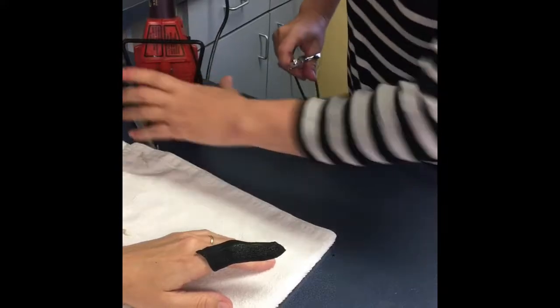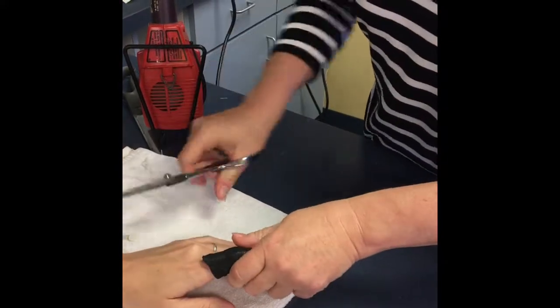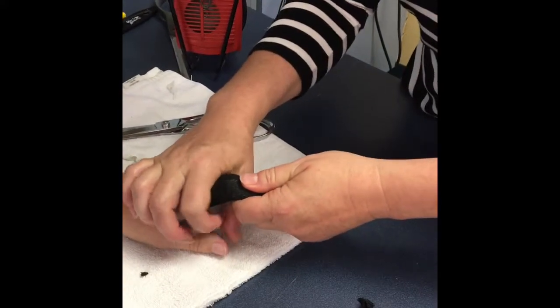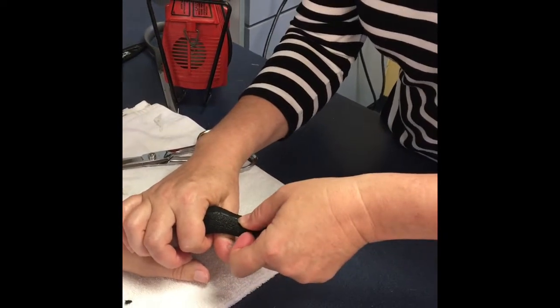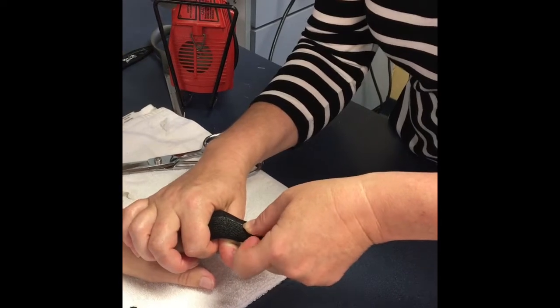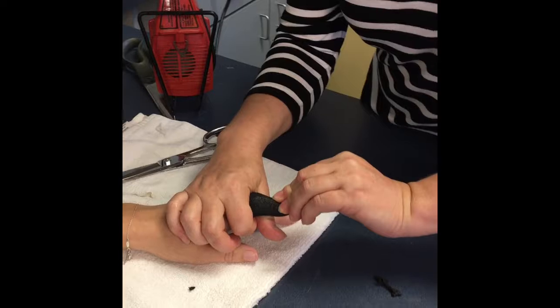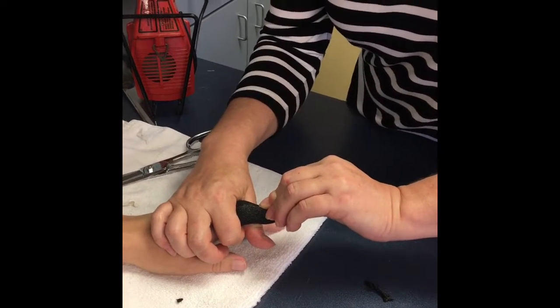If there's a point, you can trim that just a little bit. I'm then going to position the PIP in about 30 degrees of flexion and the DIP in between 0 and 15 degrees of hyperextension. The variability in that angle is determined by the contralateral index finger's hyperextension at the DIP.